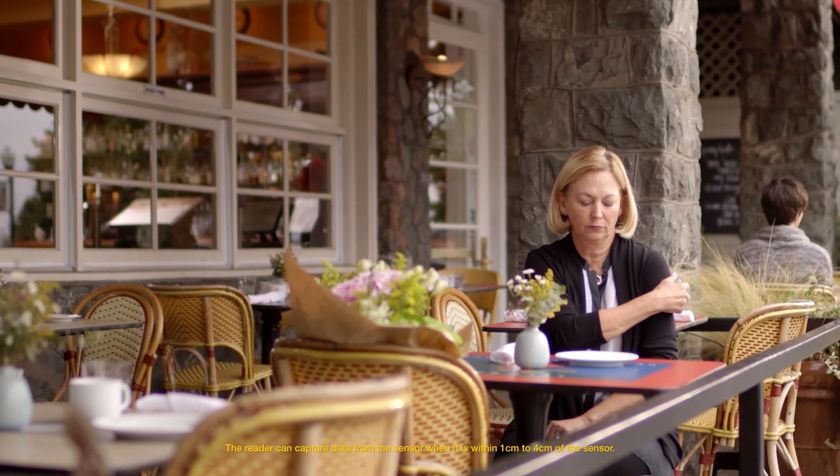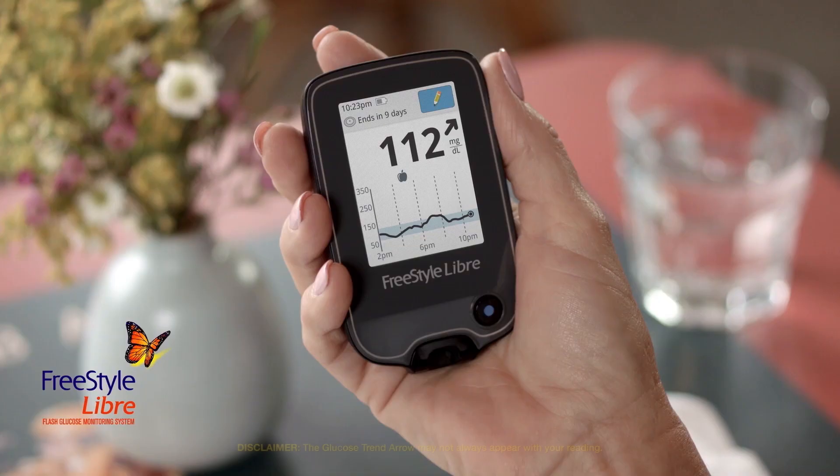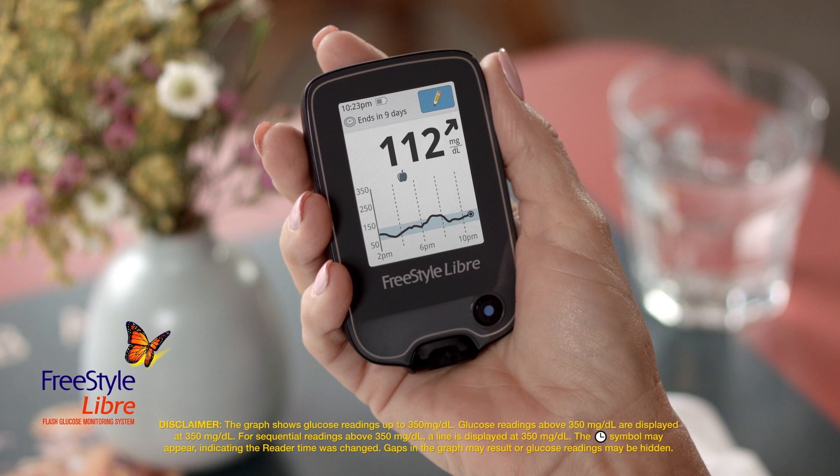Hold the reader within 4cm of your sensor to scan it. You can scan right through your clothes. When you scan, the reader displays your current glucose reading and a glucose trend arrow, which tells you the direction your glucose is going and how quickly or slowly it's changing.